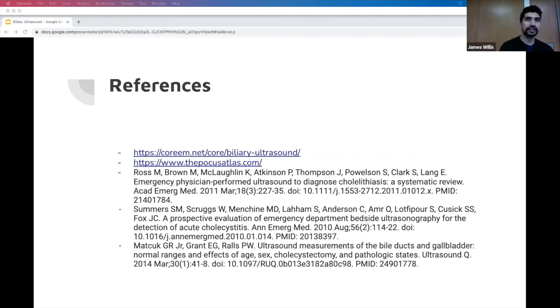Yeah, I completely agree. Like I mentioned before, when I was going over the studies I ran across, they did compare it with CT scan, which again does not have as good sensitivity. So Robbie was asking if there are any studies that compare it with tissue. Actually, one of the systematic reviews I mentioned before, I forgot to mention, also compared it with tissue, but because it's a systematic review, they compared it to multiple different things.